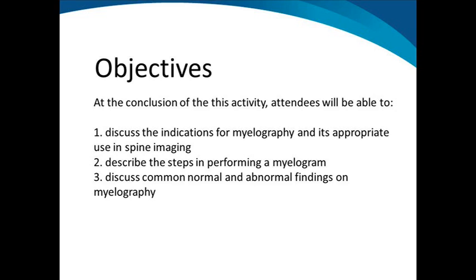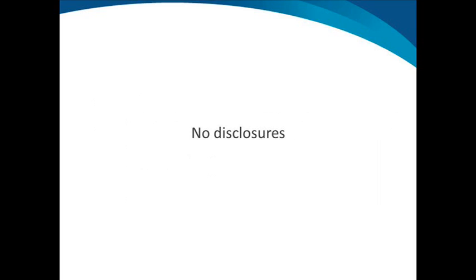Our objectives include discussing the indications for myelography and its appropriate use in spine diagnostic imaging. I'll describe the steps in performing a myelogram, which would include the pre-procedural planning and post-procedural follow-up, and I'll also share with you some common normal and abnormal findings on myelography.